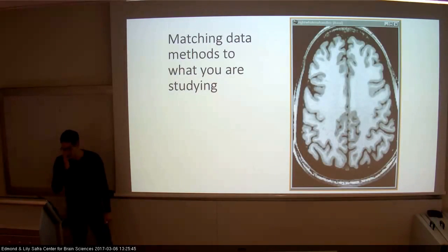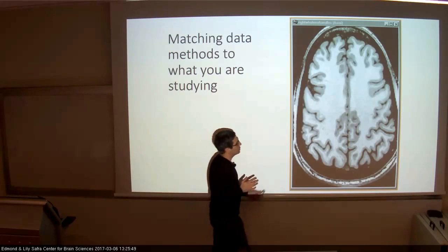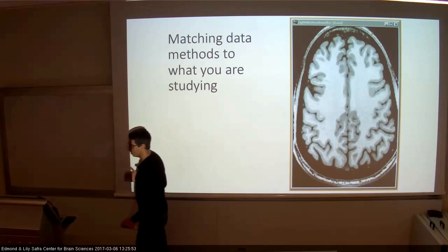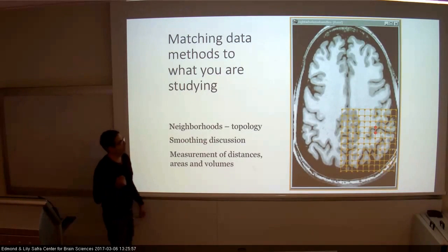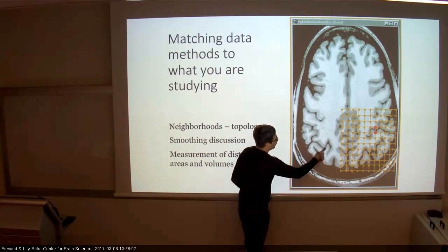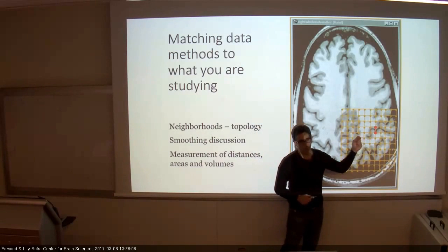Okay, so now there will be analysis on the surfaces on those images, and they will respect the image in a different way. If you remember, we're not measuring in the units of the brain. We don't measure along those surfaces. We're just measuring in some grid. We have a value per voxel, some grid of these images.